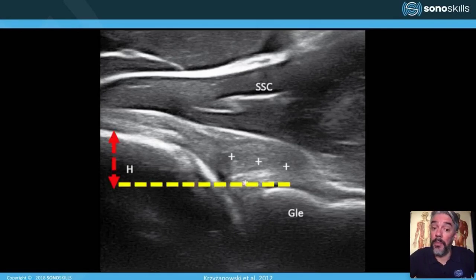And you can also measure the position of the humeral head in the glenoid cavity, sometimes with cranial migration. If the supraspinatus was fully torn, we saw that the acromiohumeral distance became smaller because of cranial migration of the humeral head. And then you can also see changes distally with this cranial migration.